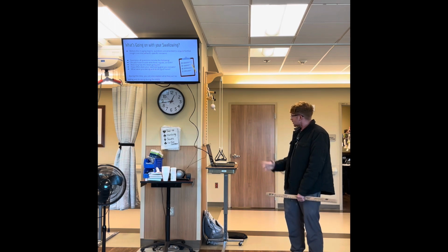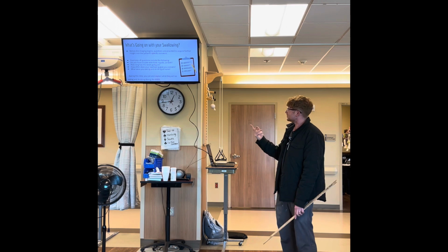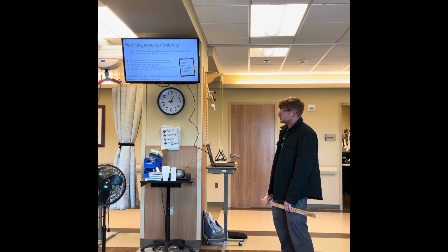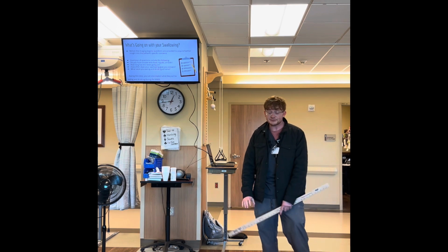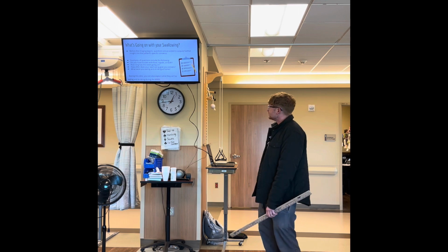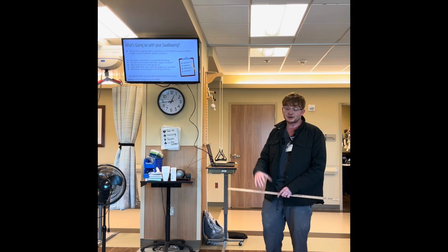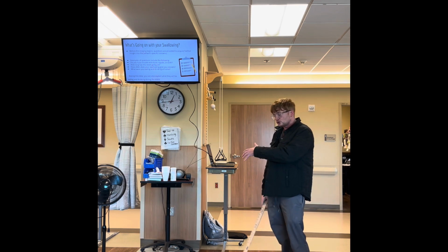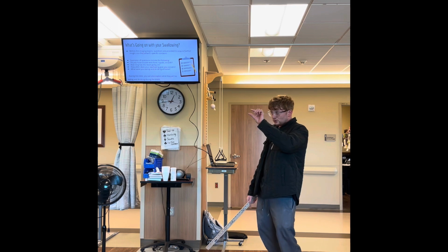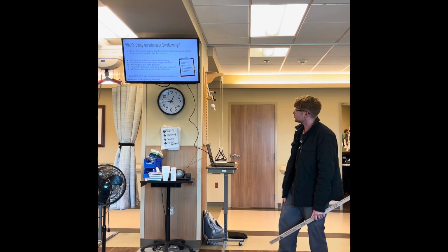So obviously we've got our materials together. Now the question I ask 95 to 100% of the people that sit down in the chair is, what's going on with your swallowing? Usually they'll tell you roughly what's going on, what concerns they're having. And you can get a lot of information from them that the chart can't tell you, because sometimes on these modifieds we're really limited to the chart review, especially if they're an outpatient modified. Sometimes you get oral phase dysphagia. That's it. And then you have to color in the rest from what they can give you.